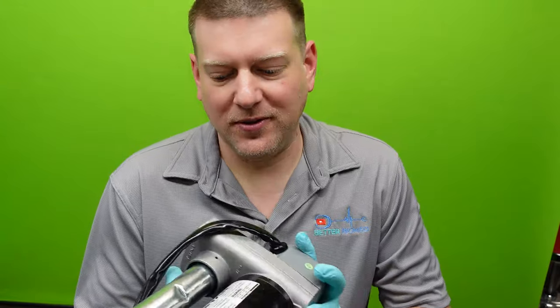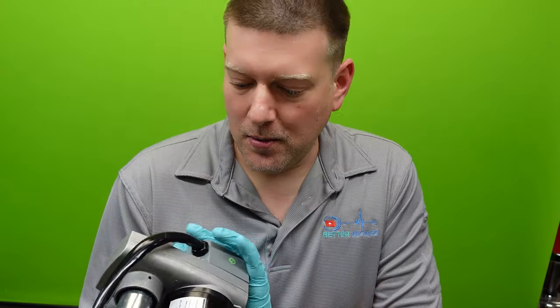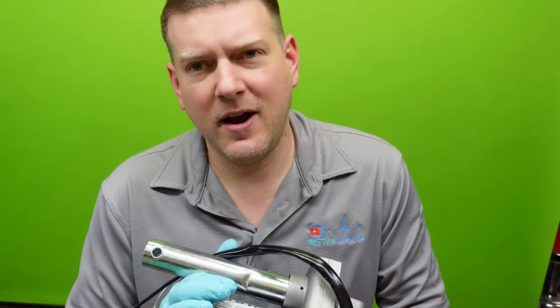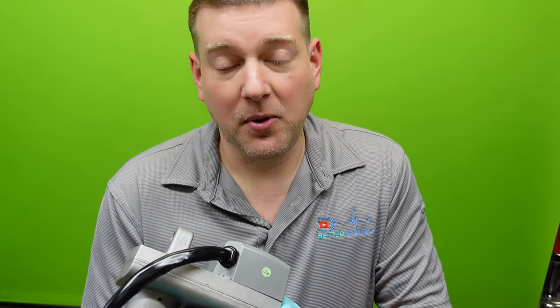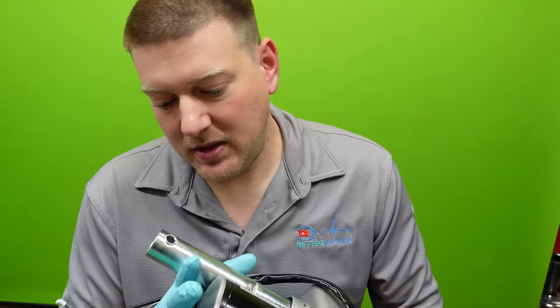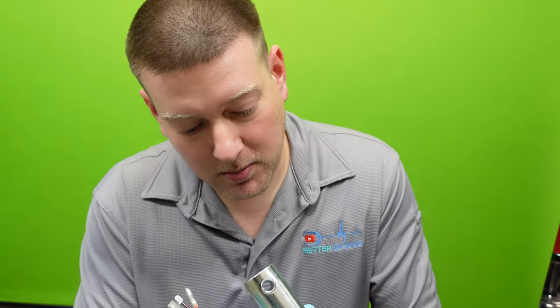Hey everyone, welcome back to Better Biomed. Today we have a special — a linear actuator I pulled out of the trash. I've never pulled one of these apart before on this channel, and I always talk about them, so this is an excellent opportunity to get into it — which is why I'm wearing gloves. I don't think there's anything wrong with this one. It was either discarded because somebody doesn't know where it belongs, or they don't know how to troubleshoot it properly.